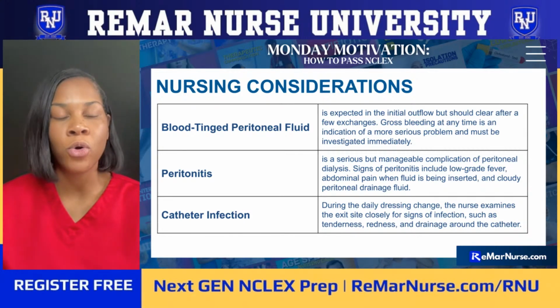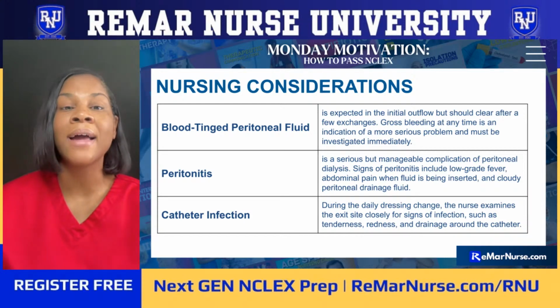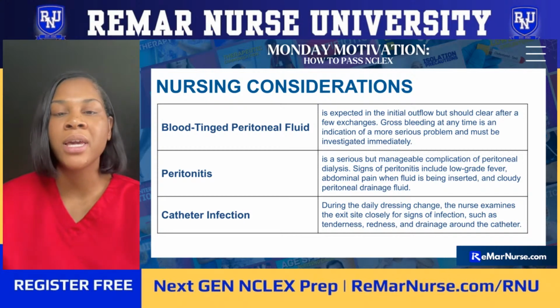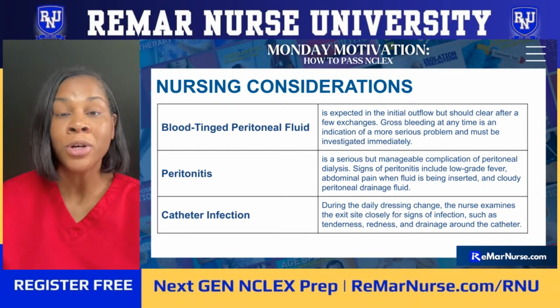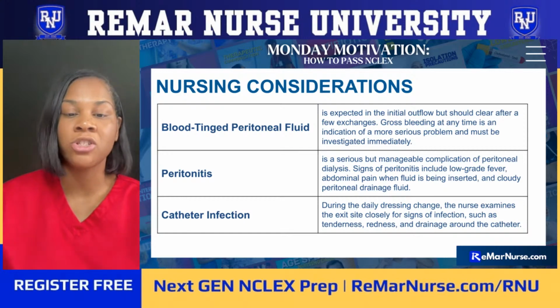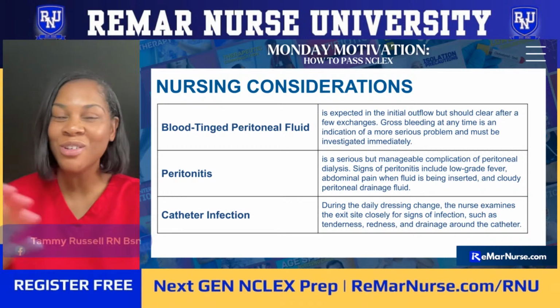Catheter infection, of course. Whenever we put something into a sterile cavity, something that is not natural to the body, it is a foreign object, and there is a possibility of infection. So during a daily dressing change, the nurse should examine the exit site, looking for signs of infection, such as tenderness, redness, and drainage around the catheter. Good stuff. If you're a nurse, you're loving this stuff.